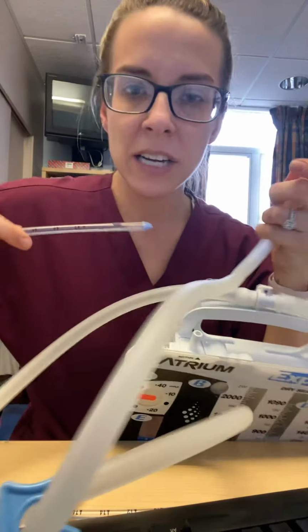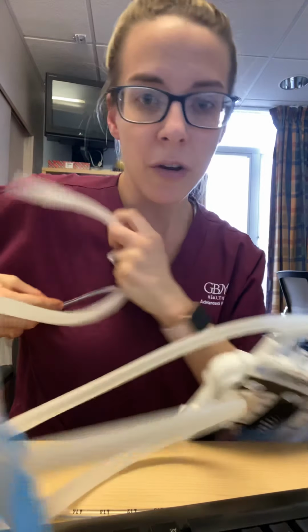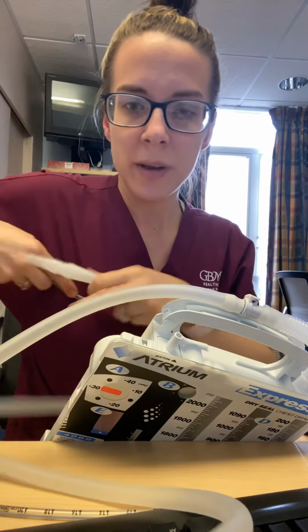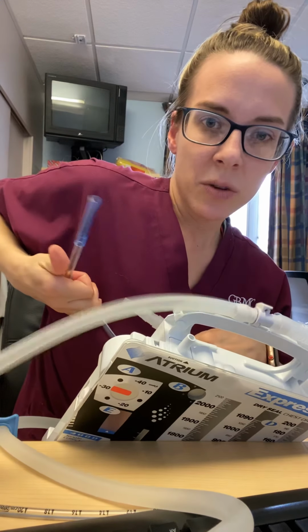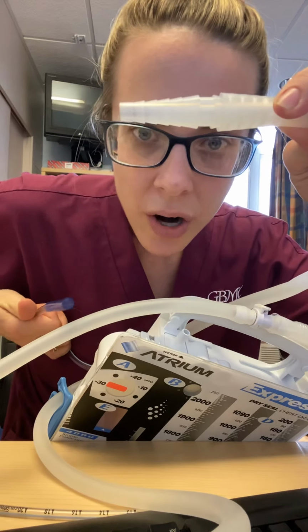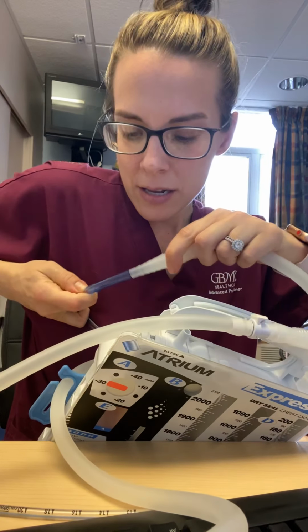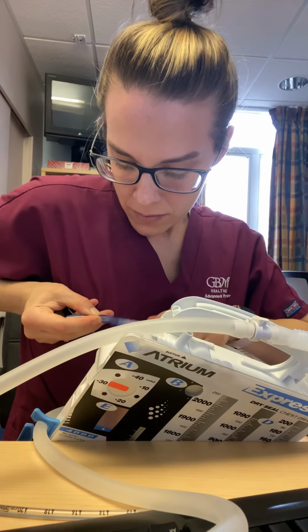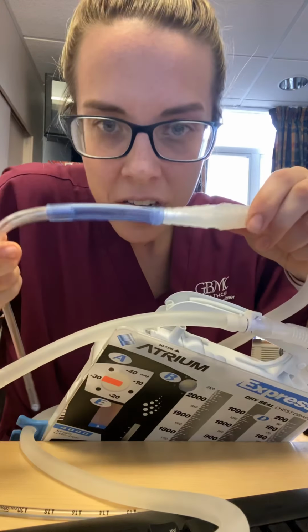Okay, so now I have my chest tube. Pretend we're in the operating room. I have my chest tube in. This is what's visible outside the skin. The surgeon is going to take the other end, which looks like a triangle football piece, and put it into the edge of the chest tube.